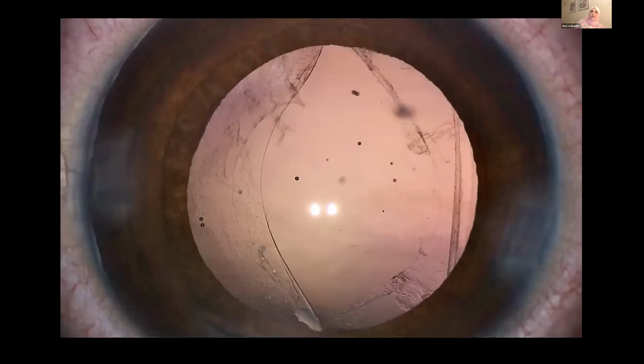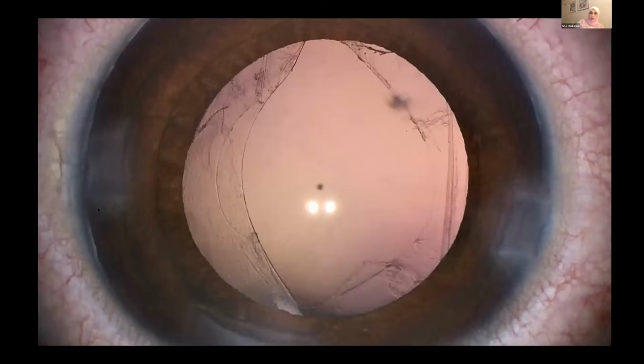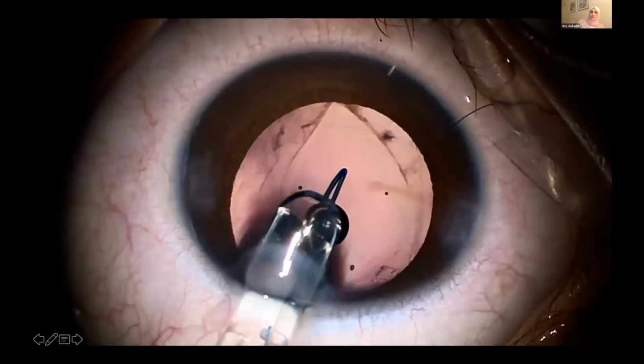We perform anterior vitrectomy, and then we are left with a beautiful support, partly by the anterior capsule and partly by the posterior capsule, where we can inject a multi-piece intraocular lens in sulcus supported by this capsule.